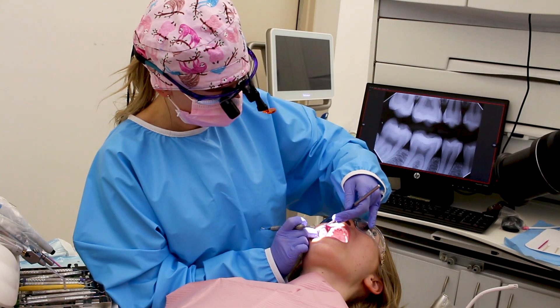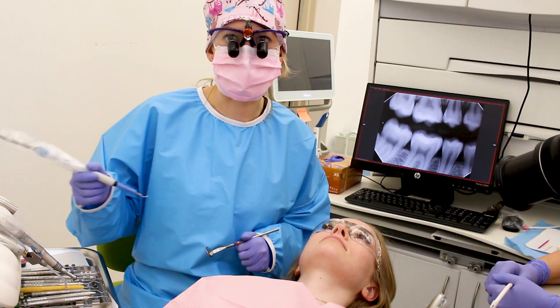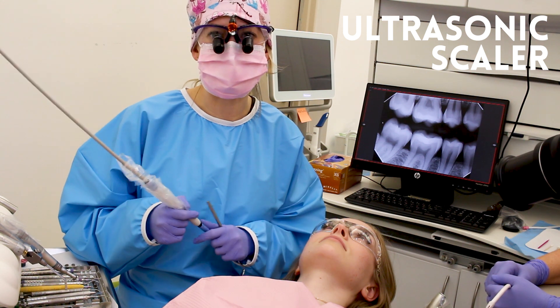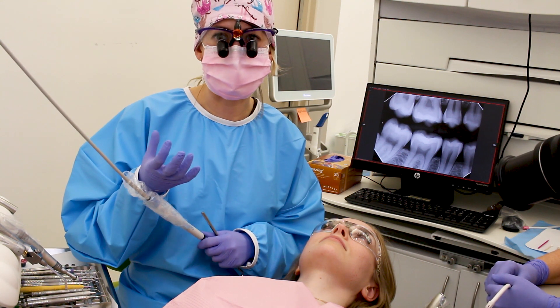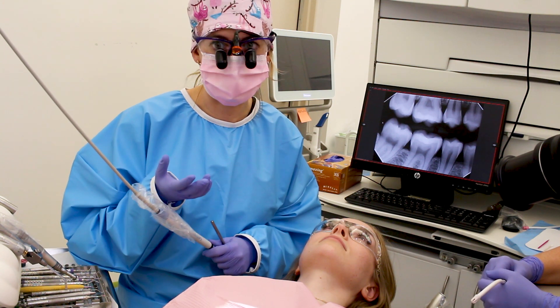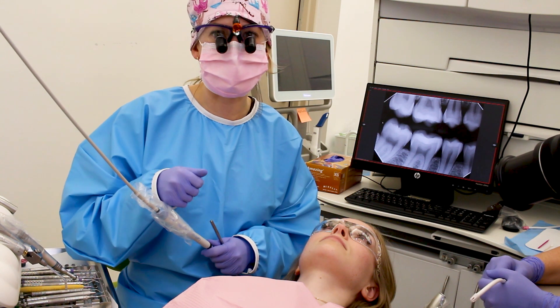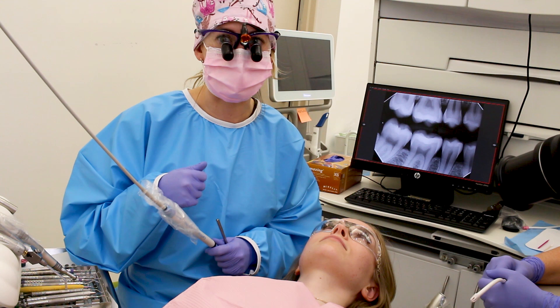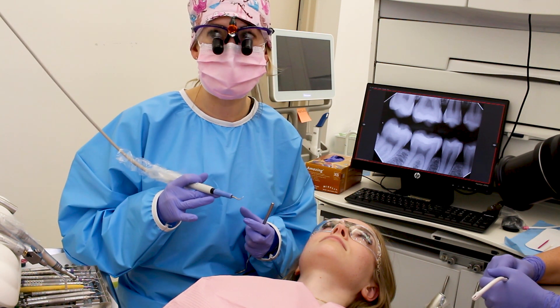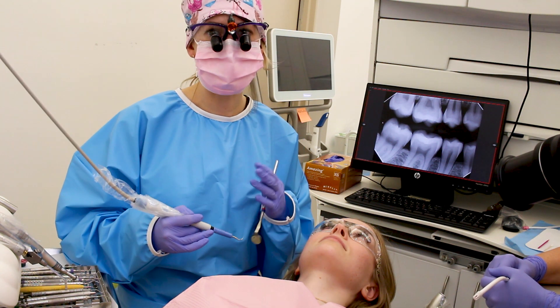A lot of the time we start the cleaning with something called an ultrasonic — in this case I have a Cavitron; another one's called the piezo. What it does is help us remove any hardened plaque called calculus on your teeth. If you try to get rid of it at home it's just not going to work — you can brush and brush but we actually need to go in mechanically and remove it with instruments we have in the dental office. It vibrates with an ultrasonic motion to help remove that calculus.